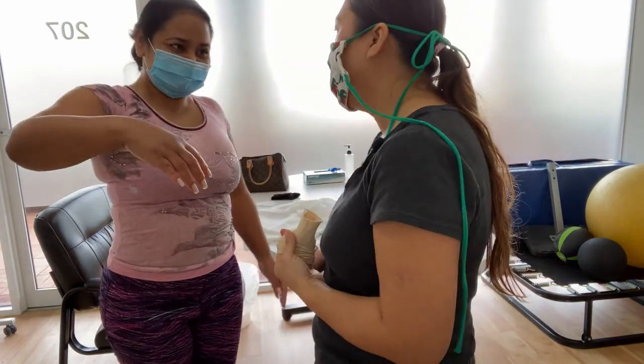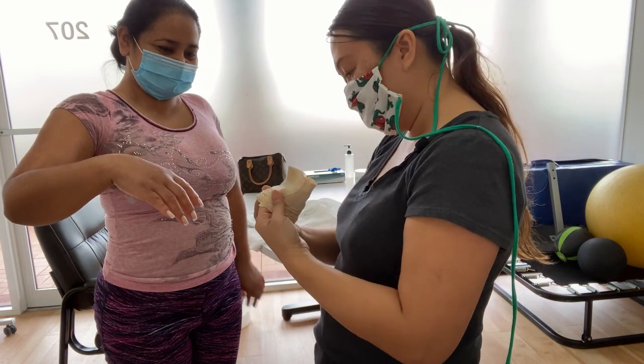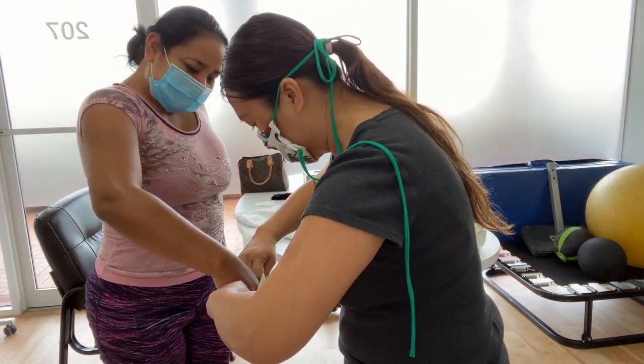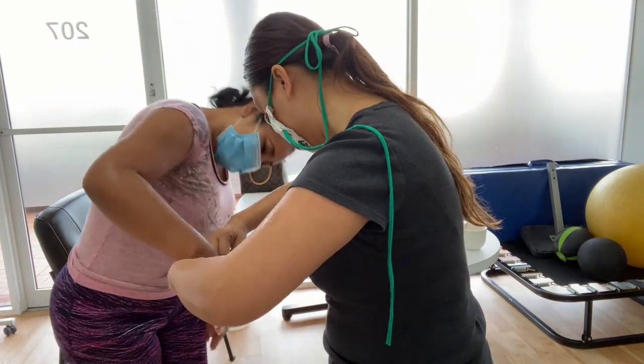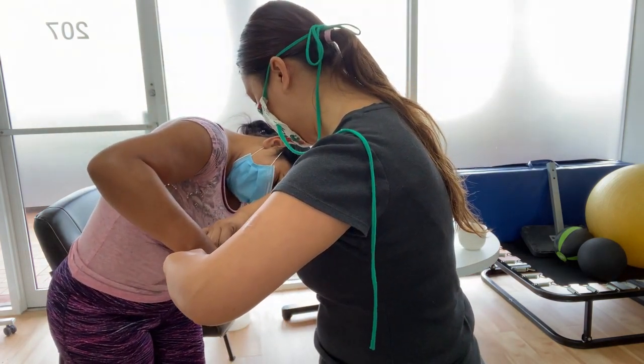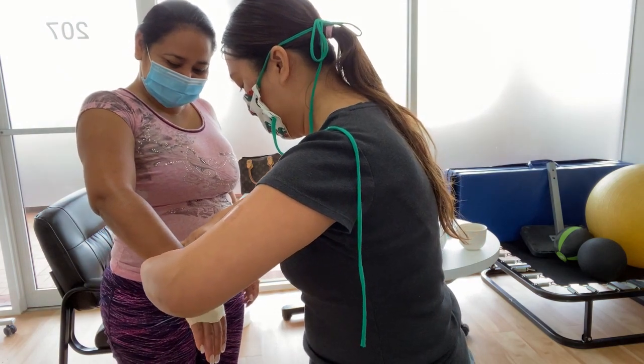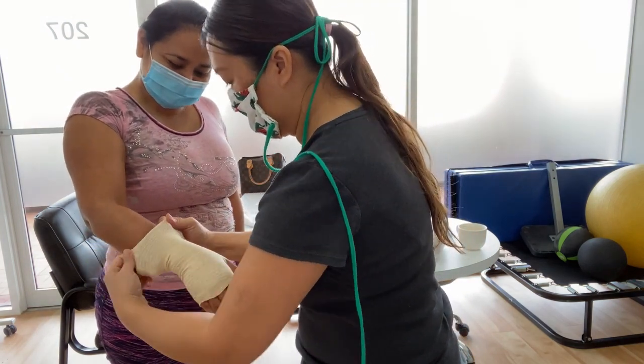So if I'm your boyfriend, you tell me: put your fingers in like this and stretch it open. And then you just slide your hand in, put your thumb in that little piece. And then we just go all the way up like this.